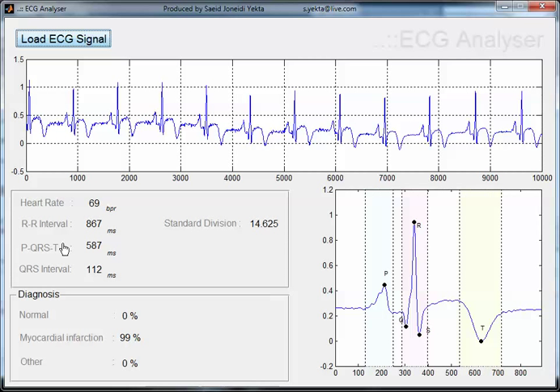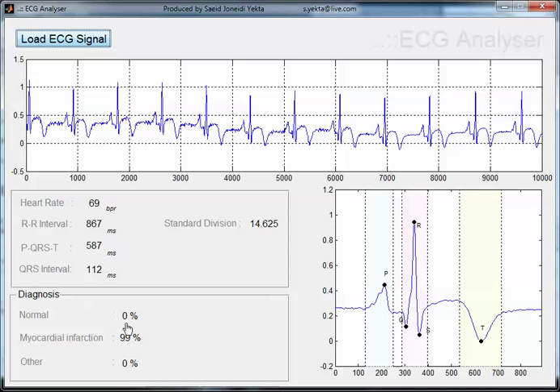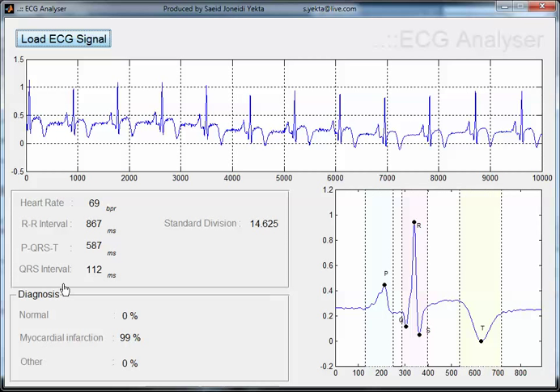In this table we can see the result of classification. This signal is categorized as myocardial infarction. Let's look at another sample.